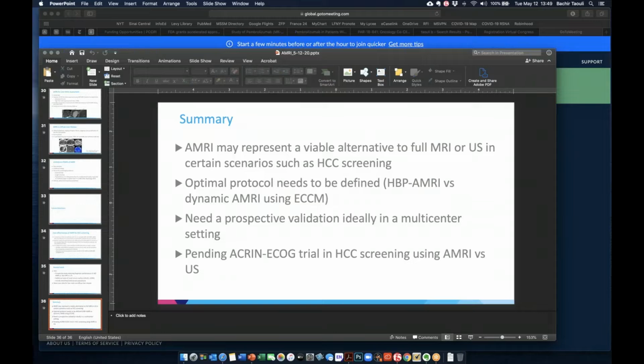Thank you, Dr. Taouli, for a great lecture. I just had a couple of questions. The data you showed for the dynamic MR abbreviated study, is it with EOVIST or was it with an extracellular agent like MultiHance? The data from our center was with Gd-EOB-DTPA, with EOVIST. Okay, do we have any data for MultiHance in any of the studies, or has everything been done with EOVIST? I think the data published is a couple of papers. They used an extracellular agent. I do not think there is any use of MultiHance published.